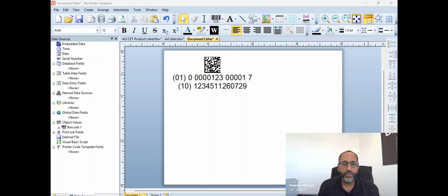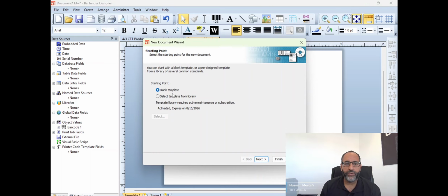In this video, we're going to create a label that has a UDI 2D data matrix, and it'll also have some medical device symbols. So in order to create a label, we're going to use the BarTender tool, which is a great tool to create UDI labels. And we're going to select a blank template from here. So go ahead and click Next.